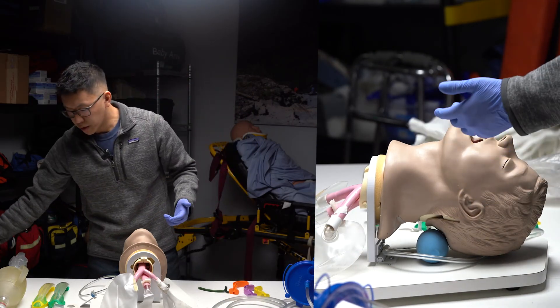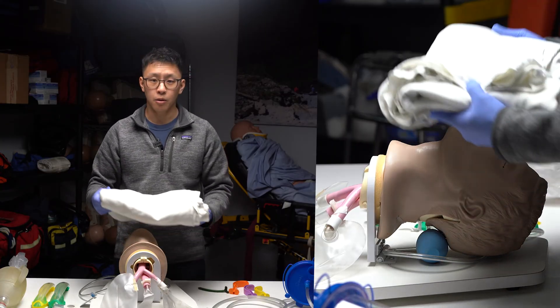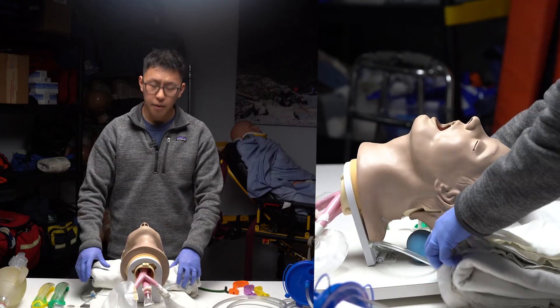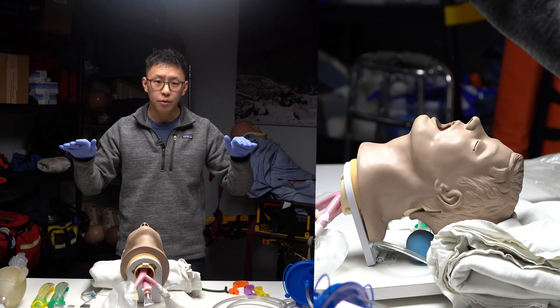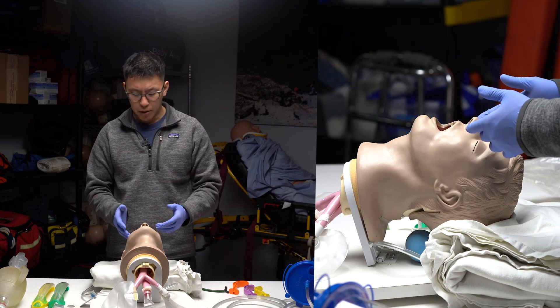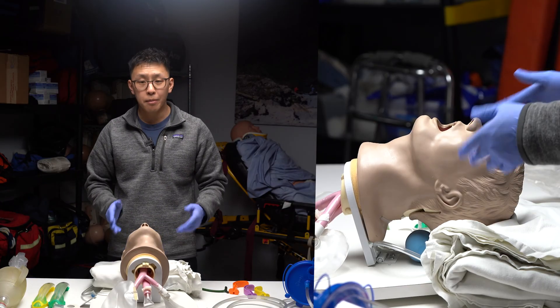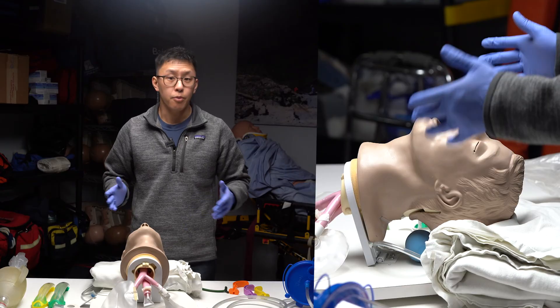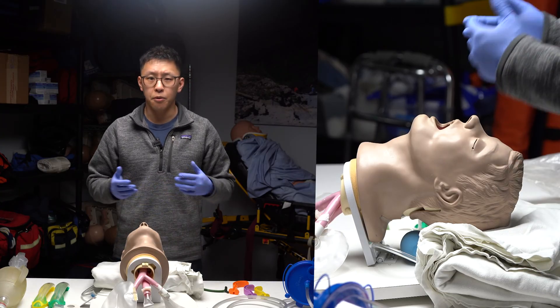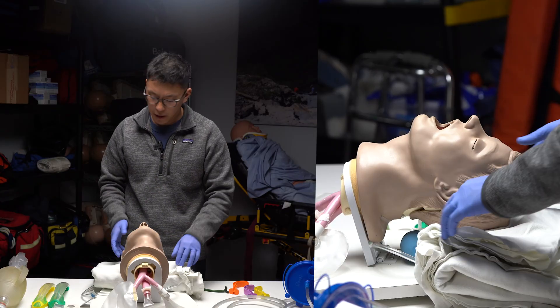With our update, we are going to provide ramping. On every table will be a set of padding — a blanket or other padding — to lift the head. The purpose is to create a horizontal line from the ears to the suprasternal notch. This allows us to place the supraglottic device more easily, minimizes the chances of aspiration, and applies to ALS as well. In the ambulance, inclining the head of the stretcher about 30 degrees accomplishes the same thing.